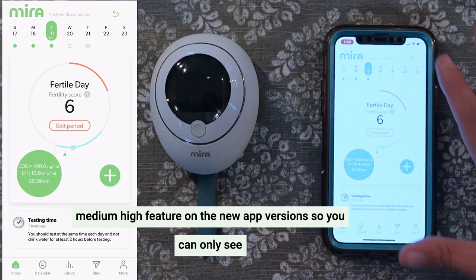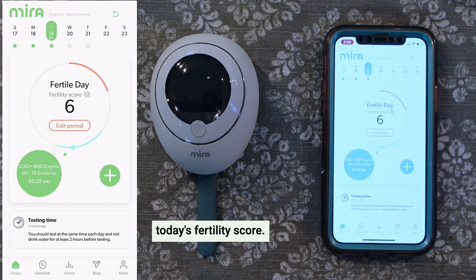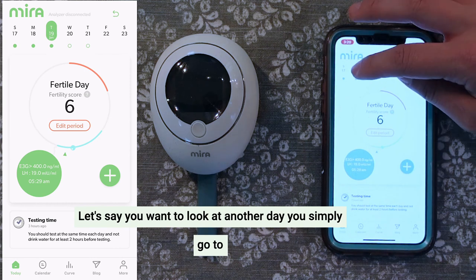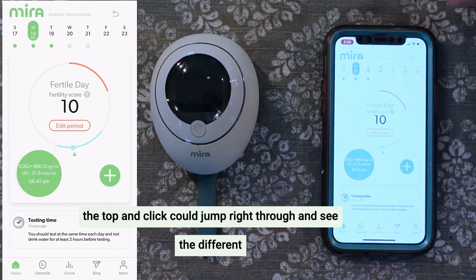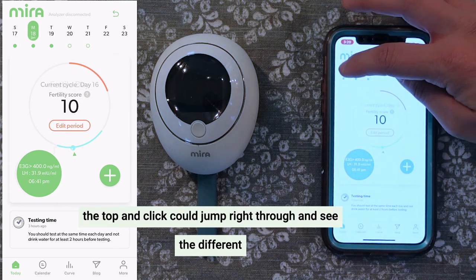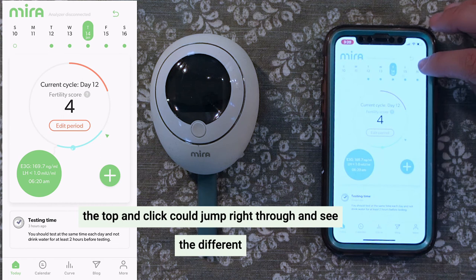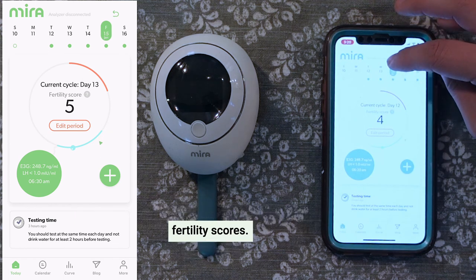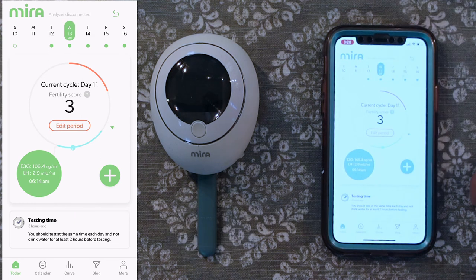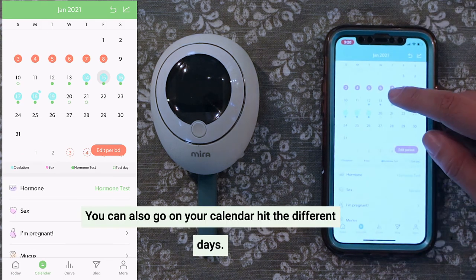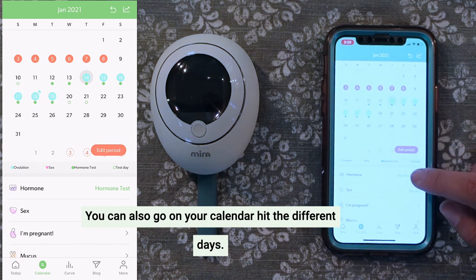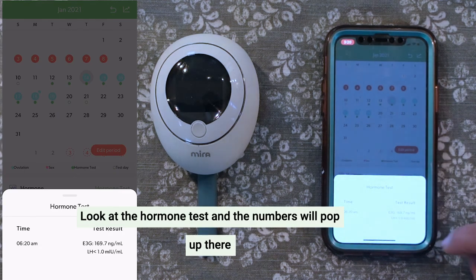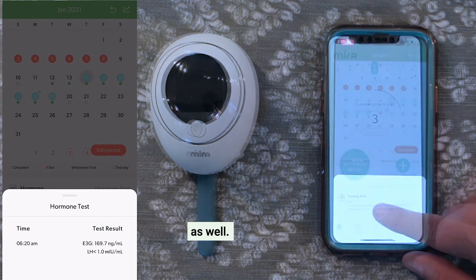So you can only see today's fertility score. If you want to look at another day, simply go to the top and click — you can jump right through and see different fertility scores. You can also go to your calendar, hit the different days, look at the hormone test, and the numbers will pop up there as well.